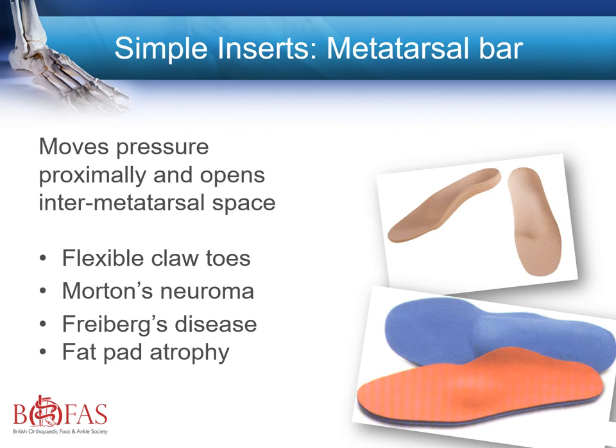A stronger semi-rigid orthotic can be adjusted, for example, by having a metatarsal bar, which allows the weight to be moved around and offloaded from areas of pathology, such as in the case of Morton's neuroma or Freiberg's.